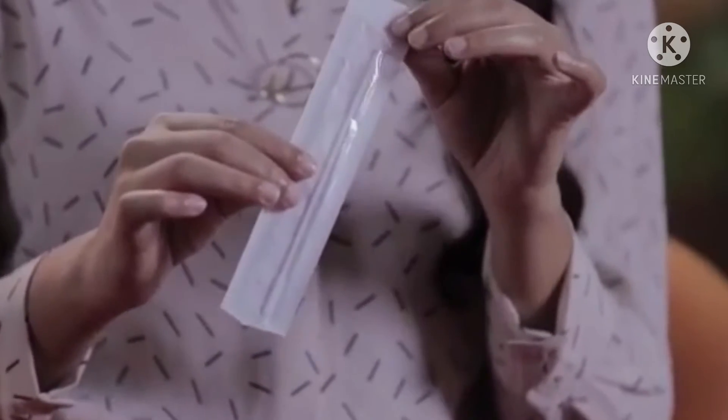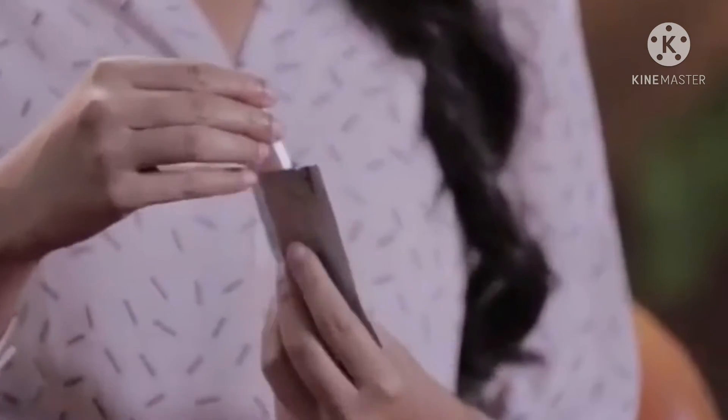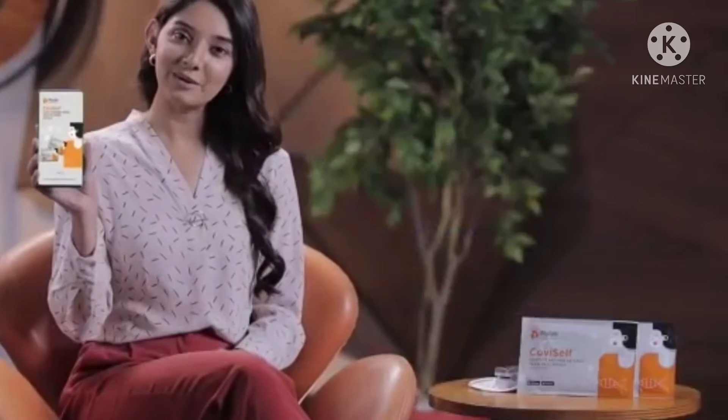This is a nasal swab. It is a cotton swab. It is sterile and without germs. This is the test kit. This is a biohazard bag. The biohazard bag is for infectious waste.